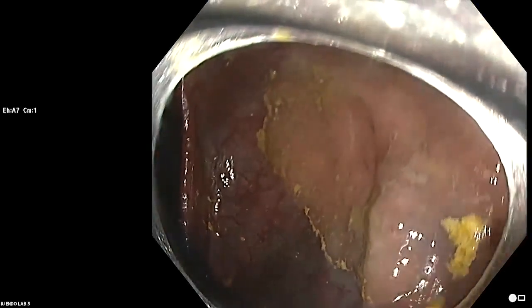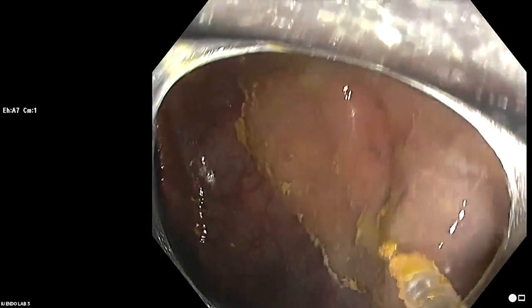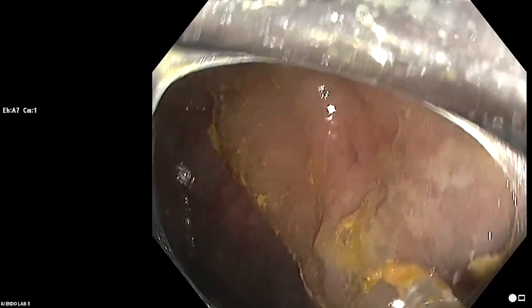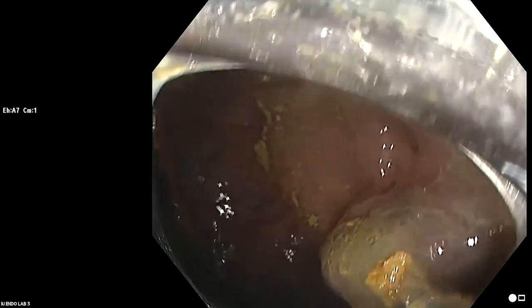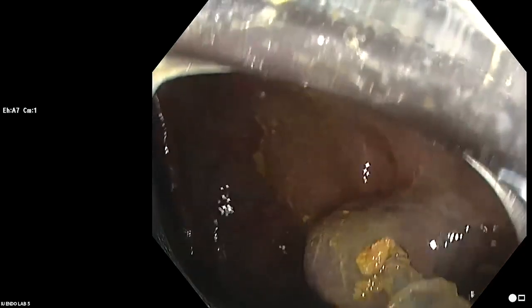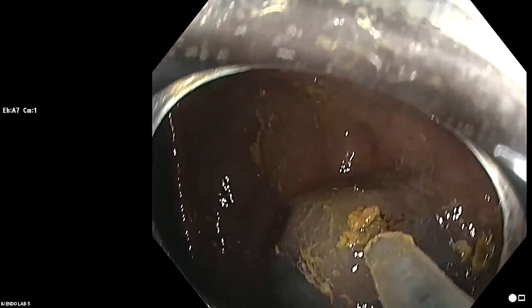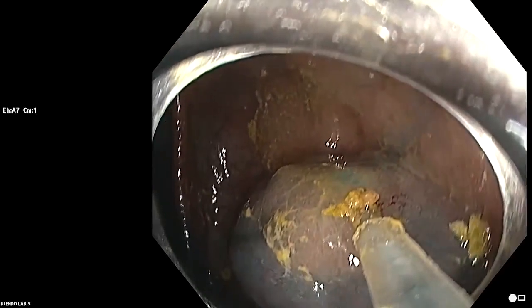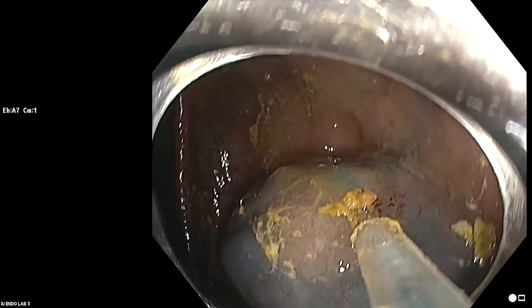So we'll put the needle in. I'm using a 25 gauge needle, and we're using Everlift, which is a cellulose based product. Try just a little bit of that, John. And it looks like that's going into the submucosa. So John's going to go ahead and fill that up. But again, I just simply don't know if we really. You can stop there, John.